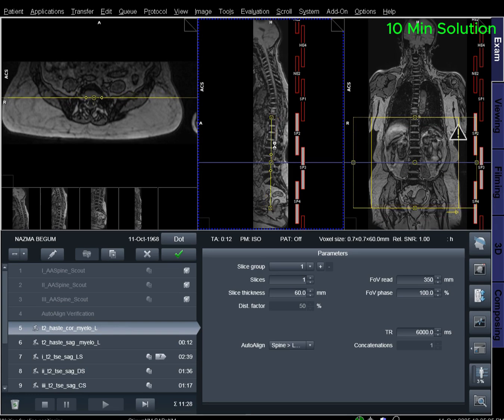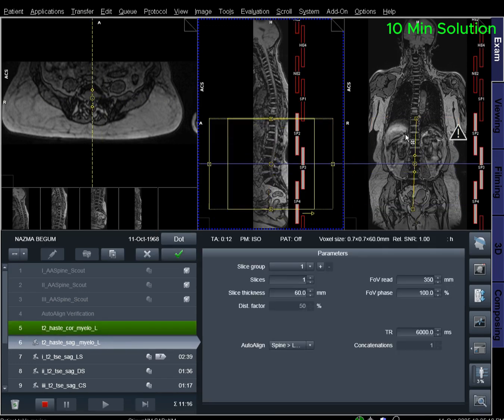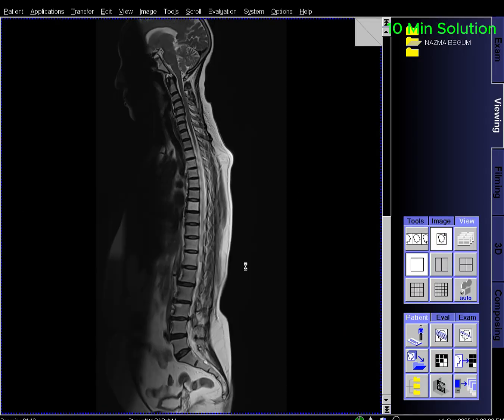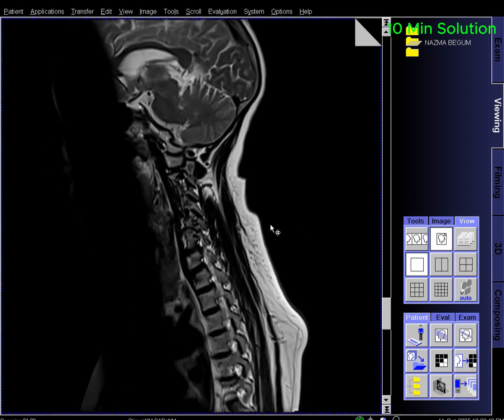Today, we'll learn how to perform MRI of the lumbar spine. This scan is one of the most important MRI studies when a patient has low back pain, disc prolapse, or suspected nerve compression. In this video, I'll show you step-by-step how to position the patient correctly, how to plan the sagittal and axial planes, and which sequences are used, such as T1, T2, and STIR.